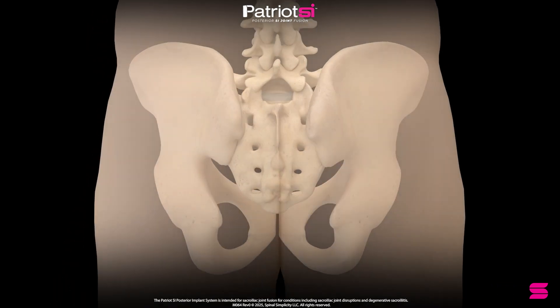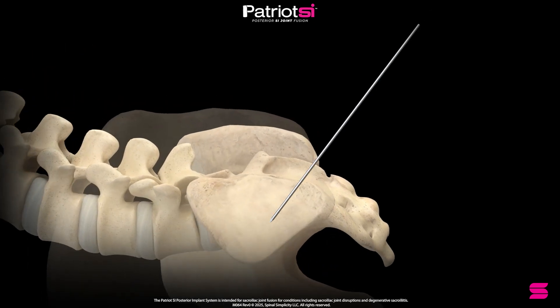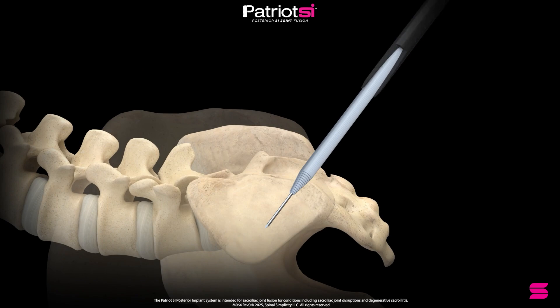With the patient in a prone position, make an incision parallel with the joint line. Insert the guide wire into the joint space. Advance the joint finder until firmly docked within the SI joint.